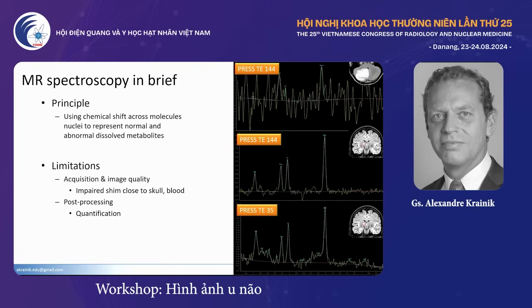And in the brain, when you do proton spectroscopy, we mostly do 2 echo times. One long echo time, quite easy to recognize. The baseline is usually very regular, very small, and you see nicely the main peaks arising from the baseline. And a shorter echo time at around 30 milliseconds, and usually the baseline is a bit more irregular, and you see maybe sometimes more peaks.